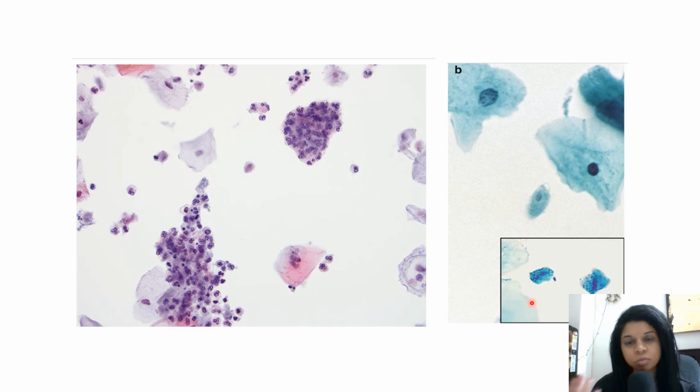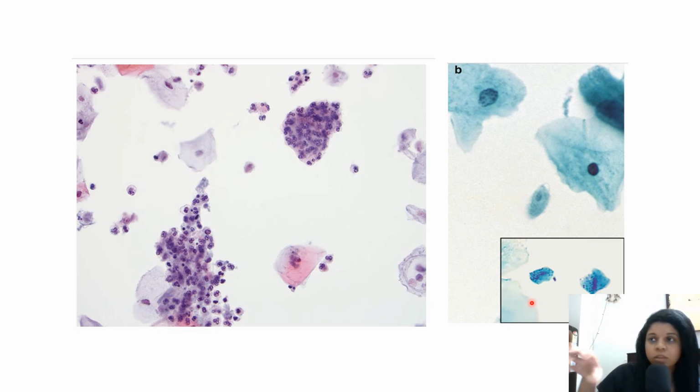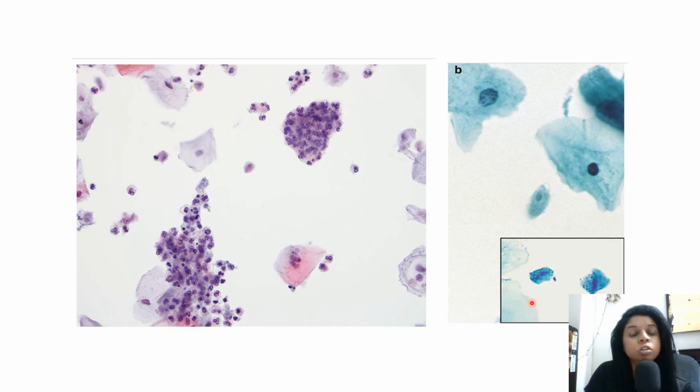So if a person is walking into a room, maybe I note the dressing style. There may be some people who look at the shoes. There will be some people who look at the makeup of the person. Some people look at the hairstyle. So it is different for different people. So for you also, you should find what is your niche, what is your point that you catch in the slide?